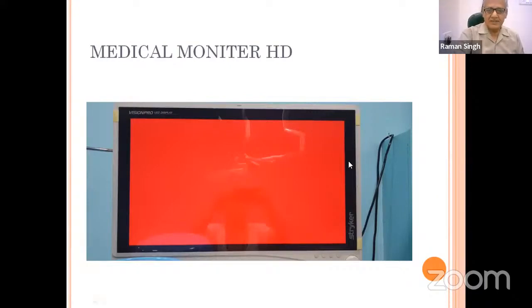After attaching this light source, we see the picture transmitting from the telescope to the monitor. After attaching this telescope, we usually balance it, which is known as white balance, because after putting a white piece over the objective piece of the telescope, this white balance is essential, because the vision becomes very clear, very natural after doing white balance.